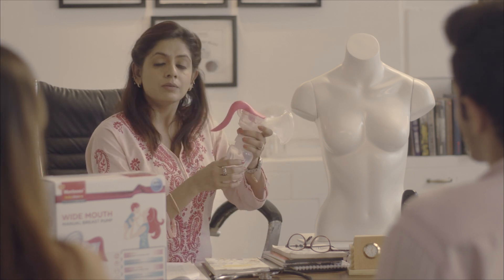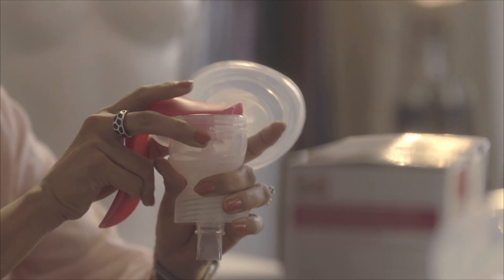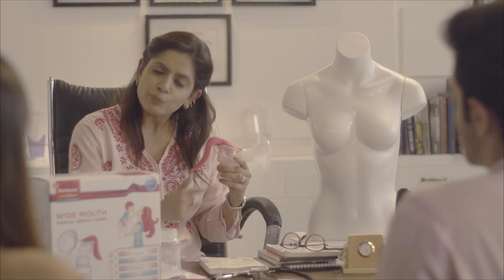Unscrew the bottle like this — you can adjust the handle as per your comfort. After you collect and store away the milk, switch to another breast and repeat the whole process. Once you finish expressing and storing your milk, clean your pump with Morrison's bottle and accessory cleaner, then put all the parts to sterilize for your next use.